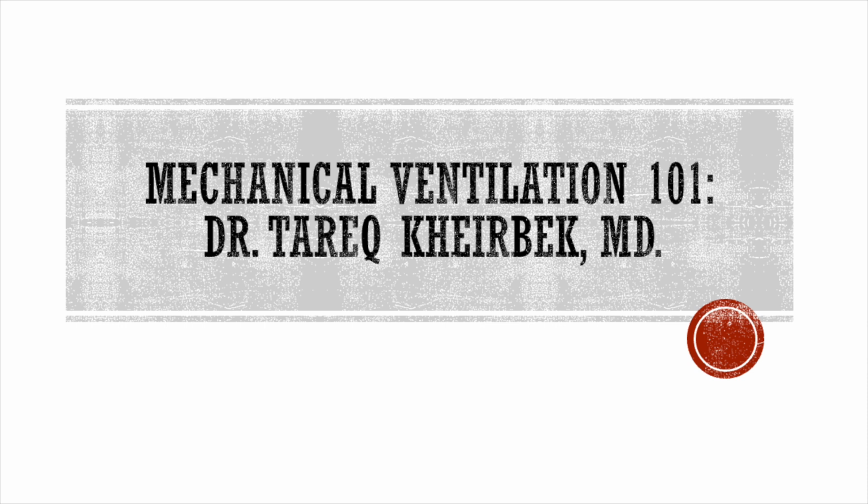So when I set the ventilator, I will then decide what is an appropriate tidal volume for a patient. We know from the ARDSNet trial that a lower tidal volume is safer than a higher tidal volume. In somebody who has acute respiratory distress syndrome, or ARDS, you want that volume to be about 4 to 6 mLs a kilogram of ideal body weight. In somebody without lung injury or ARDS, we accept a volume between 6 to 8 mLs a kilogram. So usually 6 mLs a kilogram of ideal body weight is the number that I go to when I'm setting up the ventilator initially.